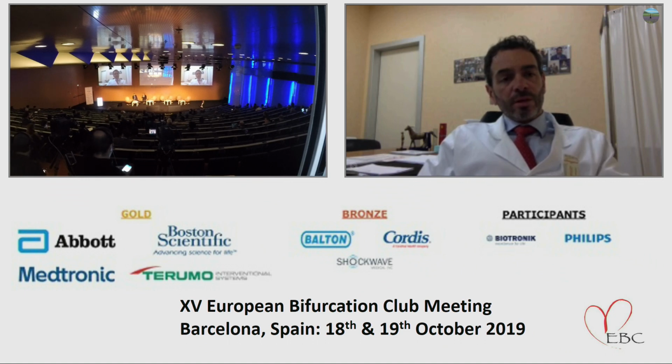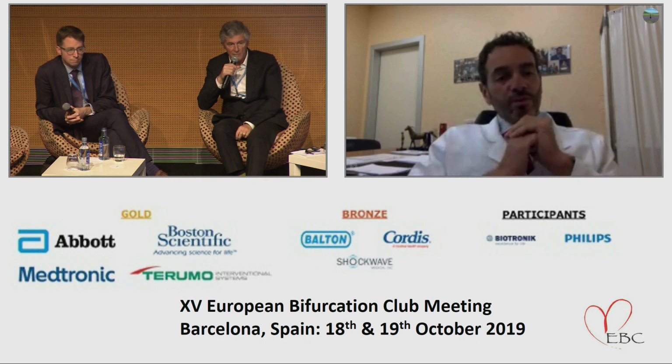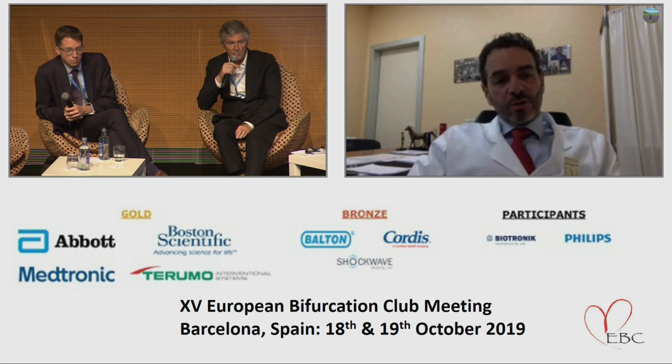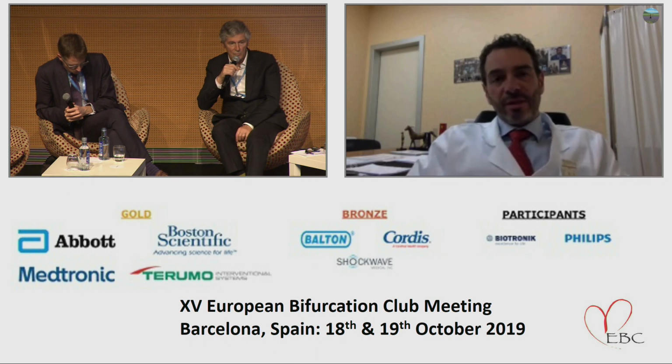Okay, so I think it's time to... Well, in this specific case, this was a lady, yeah, go ahead, Bernardo, who was 160 centimeters tall. So I think the 4.5 was a good dimension, also because it was guided by the OCT. However, I totally agree with you that the final result after the second PCI was not very acceptable. But that's what we managed to do.